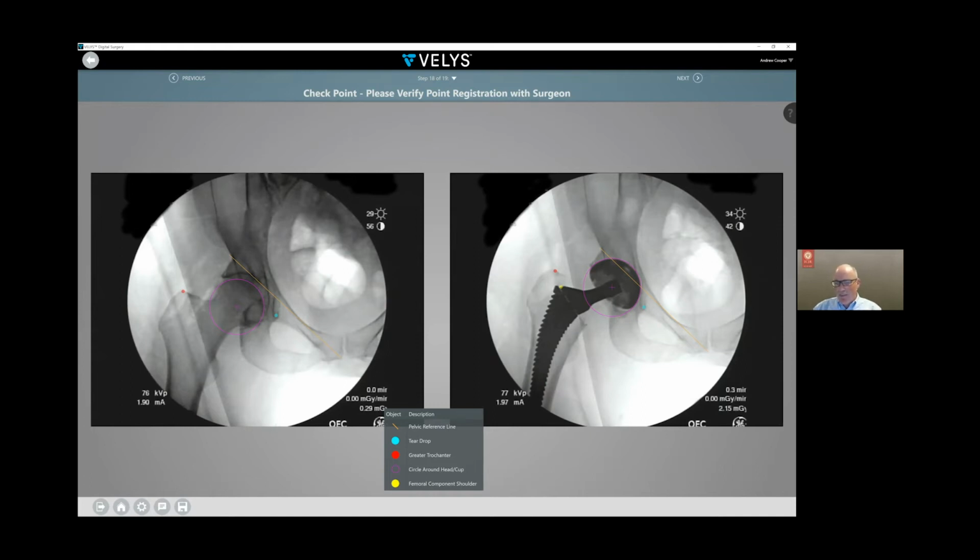But as you can imagine, once I put my acetabular component in, I'm going to analyze that x-ray and get an analytic on what my cup position is. And then at that point, I'm going to broach the femur and get my trial x-ray. And as you can probably imagine from this trial, I have all the relevant data to give me a perfect template. I kind of know exactly where I put my cup.